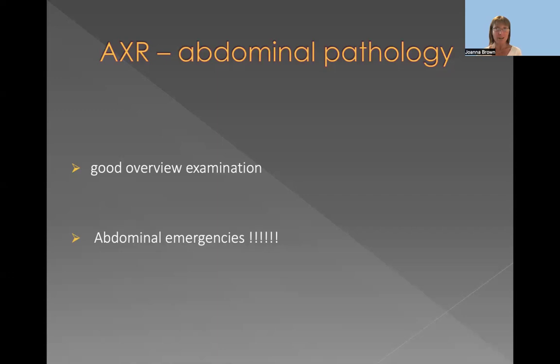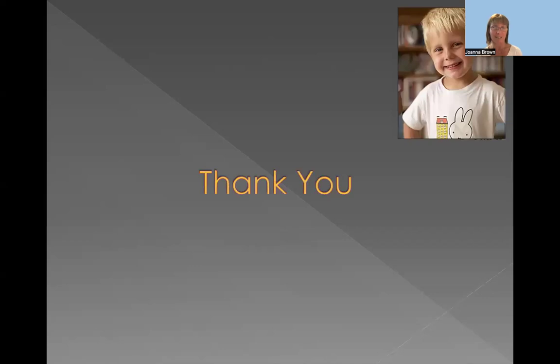Yes, pediatric radiologists, we are training with this and we are helping as much as we can. But I think that the abdominal X-ray is now such a common test that it is performed everywhere. It should be read by everyone. And it's in your hands that you can avoid delays in treatment of your children if you look properly and diagnose the emergency on the X-rays.